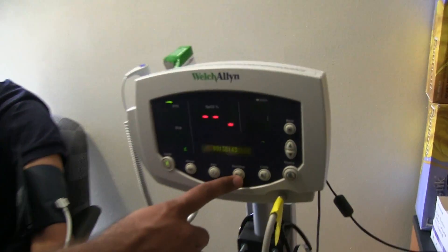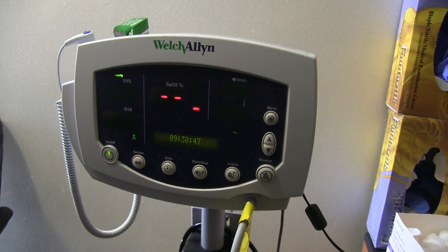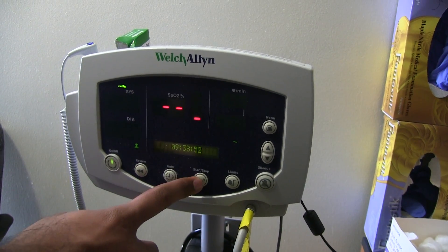Then all you do is click this button — it says start and stop — which will take their blood pressure. At the same time, this will measure the heart rate as well, so you'll get both values from that.